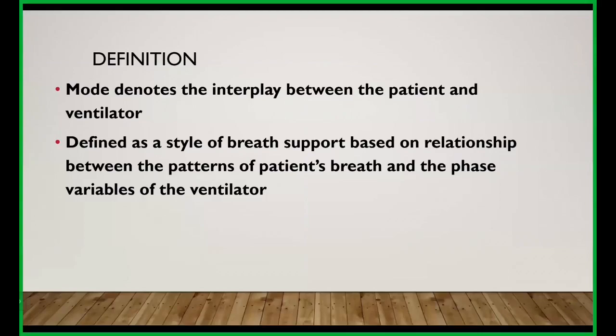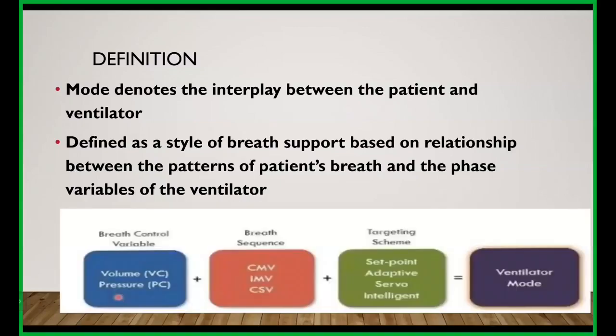By definition, a mode is a tool that interacts between the patient and the ventilator. It can be defined as a sequence of breath delivery, which is based on the relationship between the ventilator's phase variables and also the patient's respiratory patterns. This can also be a combination of these three: breath control variable, breath sequence, targeting scheme.